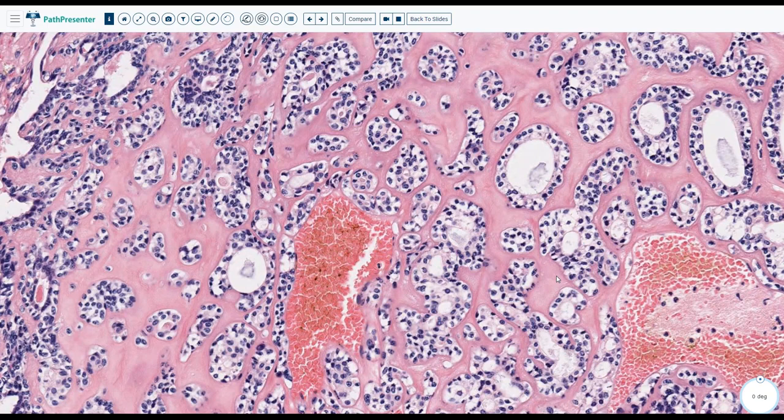So when you have something a little bit hyalinized, which is the differential diagnosis for this tumor, hyalinizing, think of this. So this is epithelial myoepithelial adenoma or carcinoma. Looks very bland, huh? There is a capsule. Yeah, there is a capsule. So you would call it epithelial myoepithelial adenoma or carcinoma.